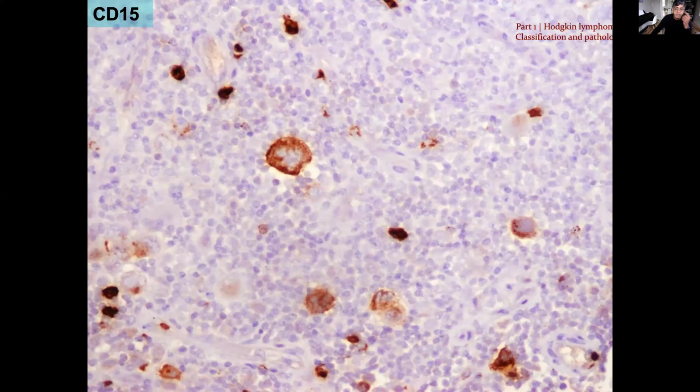And in CD15, you do easily find your high positive internal controls, which are your background neutrophils. And your low positive controls that you want to look for are small cells like these. These are your monocytes. So once you see this range of staining, the weak and the super strong, then your CD15 is technically satisfactory, and you can believe the status of CD15 on these cells.